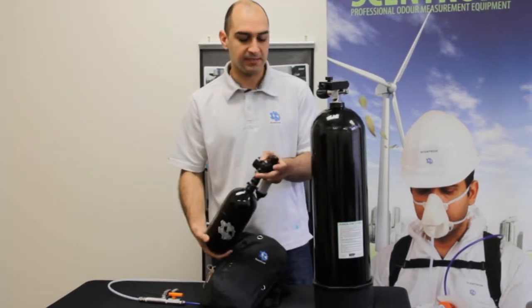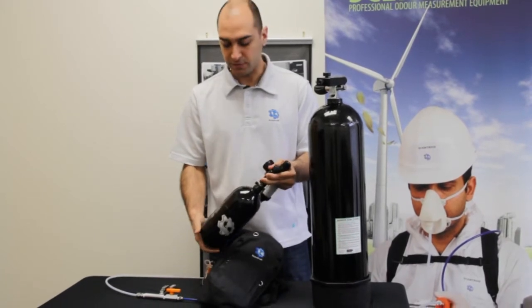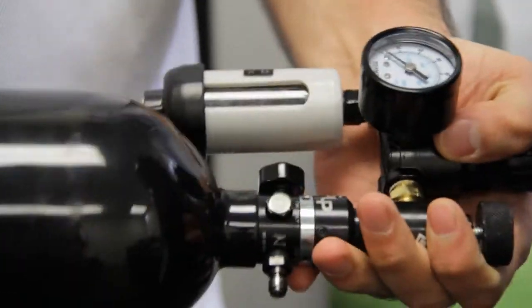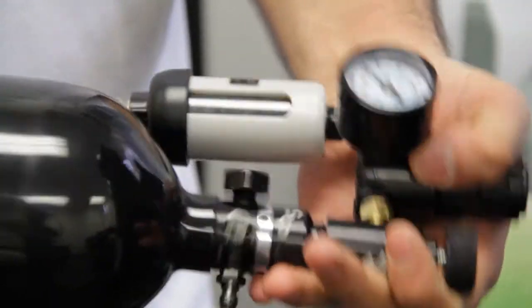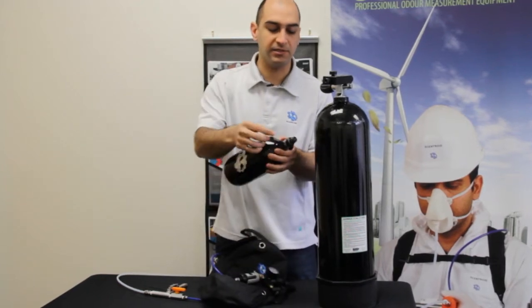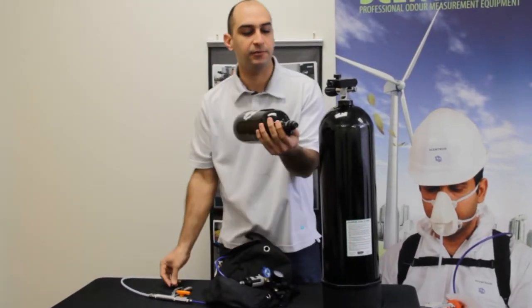The first step is to make sure that the valve is closed and there is no pressure on the gauge. Then just unscrew the tank. If your tank has the little protector here on the fill nipple, take it off.